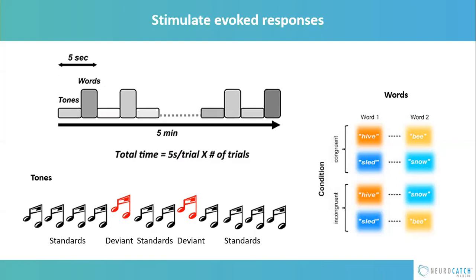When you get the N400, they're averaged together, but just FYI, we actually know how to pull that out and look at it. And we've been able to demonstrate that the context aspects are particularly sensitive to things like dementia. Next slide, please.